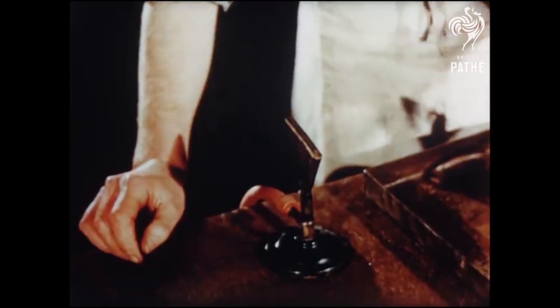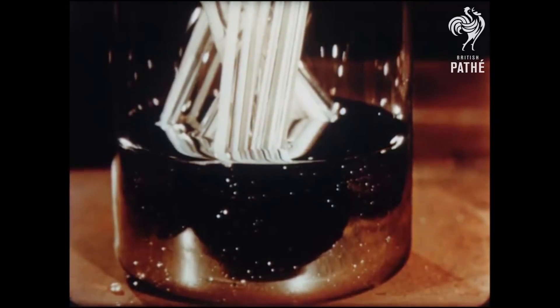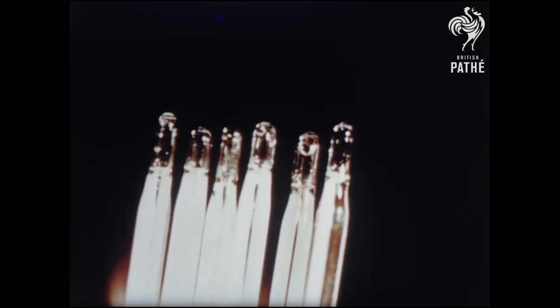The mercury comes from Spain, Italy or Mexico, and one pound of it will fill about five hundred clinical thermometers.